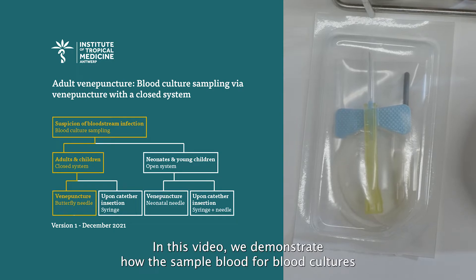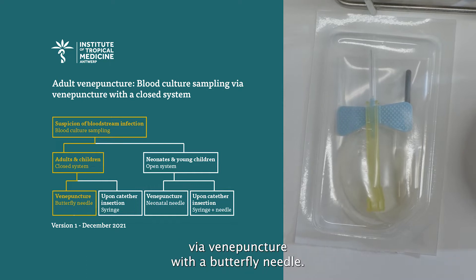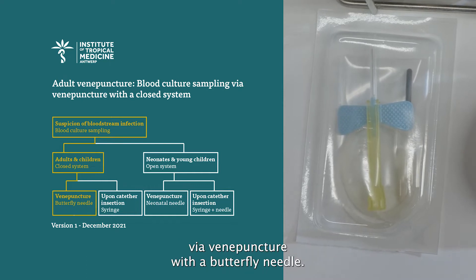In this video, we demonstrate how to sample blood for blood cultures via venipuncture with a butterfly needle.